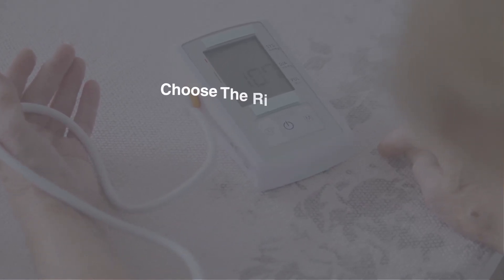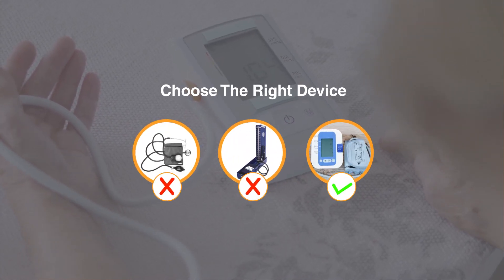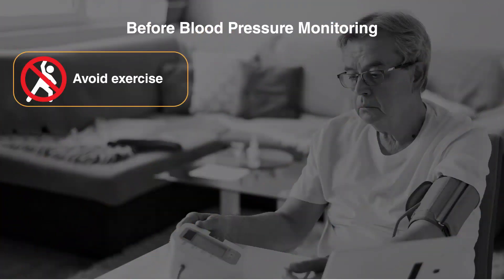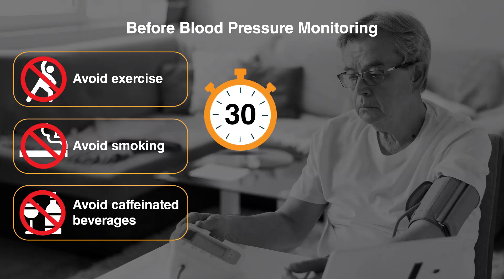A simple and reliable choice of device would be to use an automatic upper arm measuring blood pressure device. Avoid exercise, smoking, and consuming caffeinated beverages at least 30 minutes prior to monitoring.